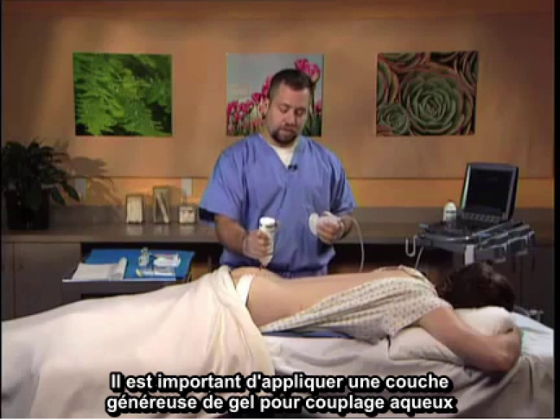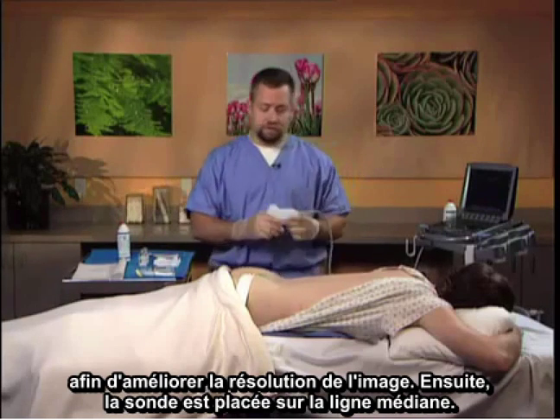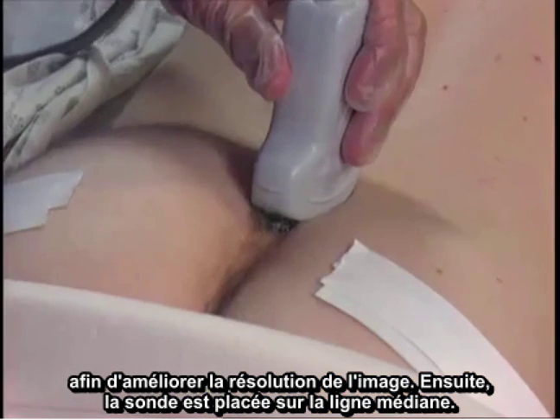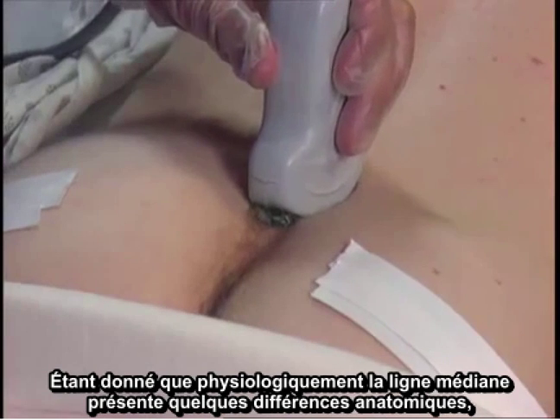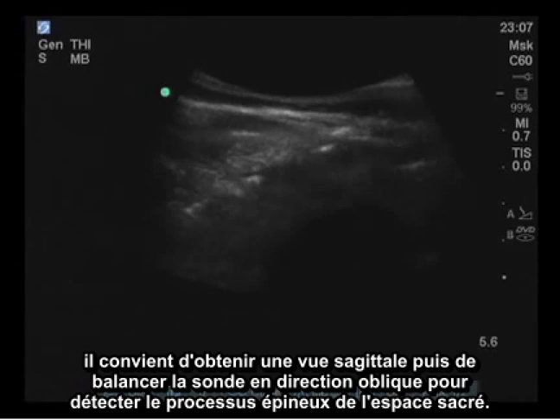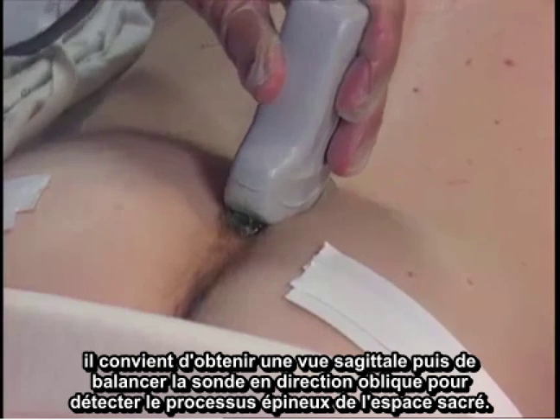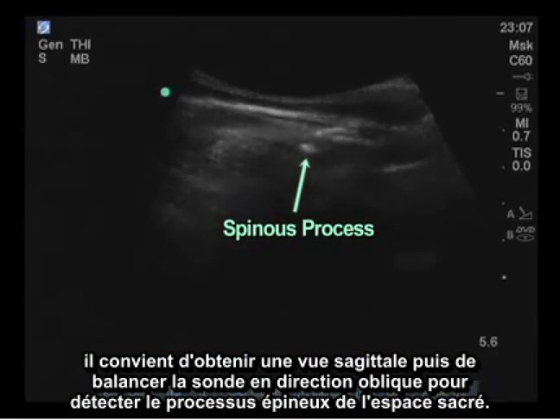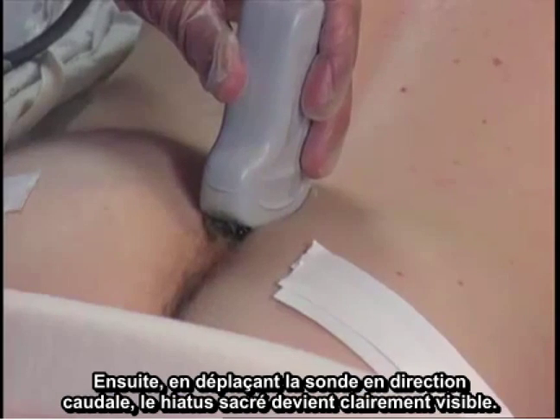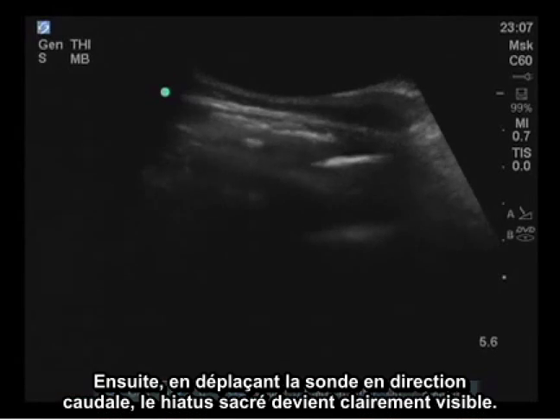Placement of a copious amount of gel for aqueous coupling is important to enhance resolution on the screen. Contact is made in the midline. Because there is anatomic variation in the midline physiologically, a sagittal view and then gently rocking the probe in the oblique direction can help find the spinous processes of the sacral space.